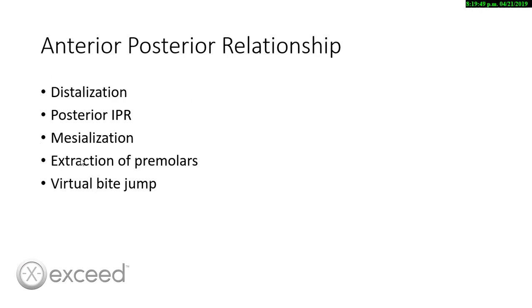Messialization, that is a little bit harder than distalization because we need to create space before we start to messialize. Also we can do extraction of premolars or a virtual bite jump.